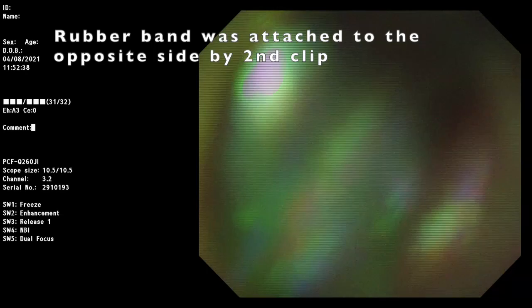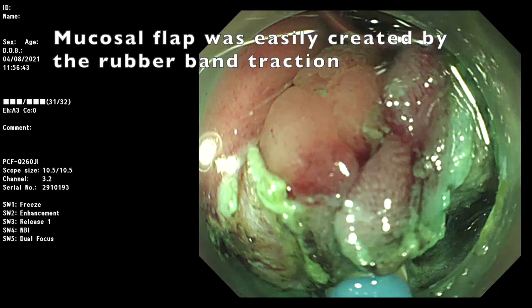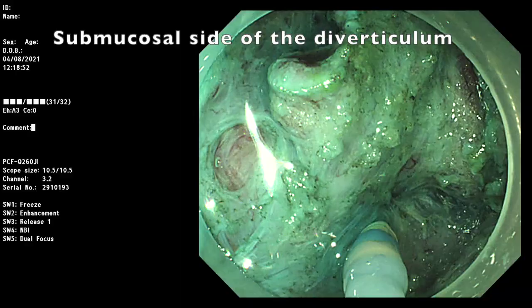A mucosa flap is easily created by this method. Here we can see the submucosa side of the diverticulum.